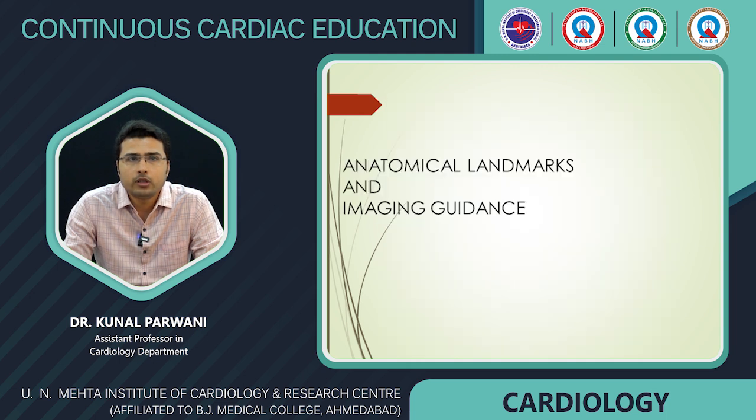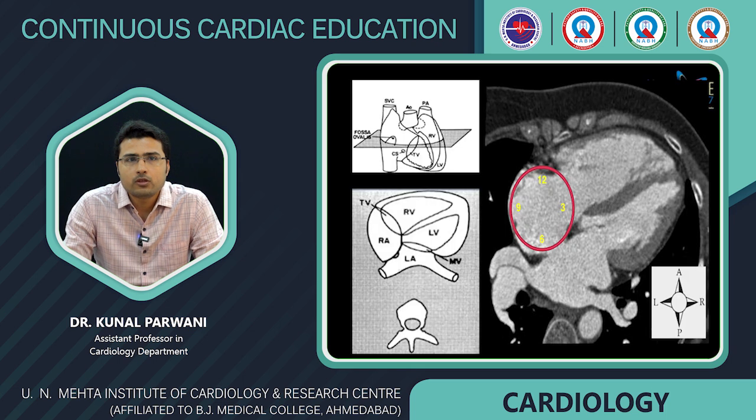Now we will talk about the important anatomical landmarks that will guide us in doing a safe transseptal puncture. As you can see in this image, if your Brockenbrough needle is in the RA and you rotate it in a clockwise direction, from the 3 o'clock to the 7 o'clock position, you will face the interatrial septum.